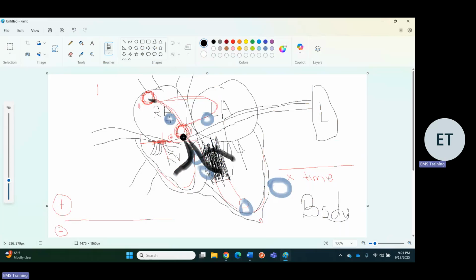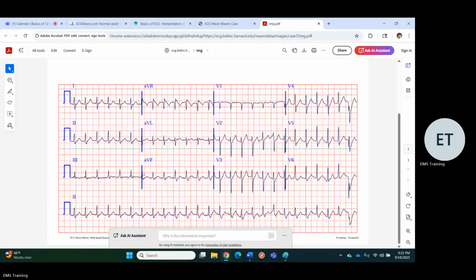You know, all the ventricles have an outflow tract between like here and here. Certain outflow tract tachycardias can do that, although this seems a little bit too narrow and a little bit too fast for that. But you know, after my lessons learned from the other ones, never discount anything, right?